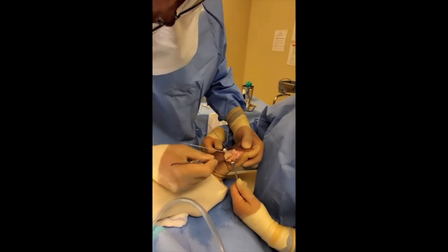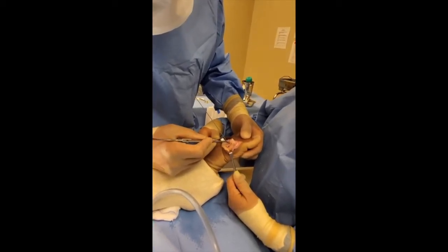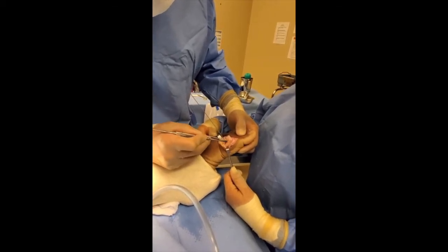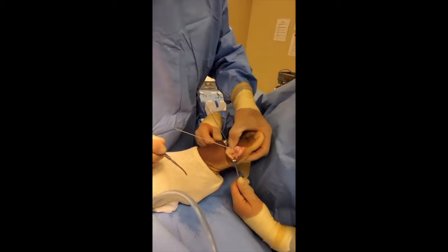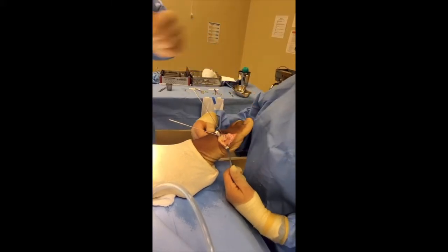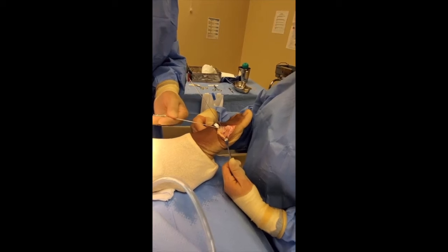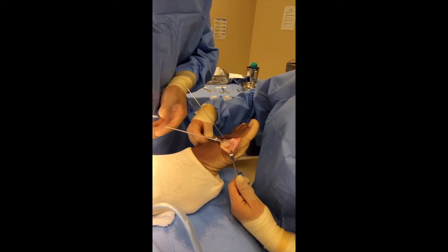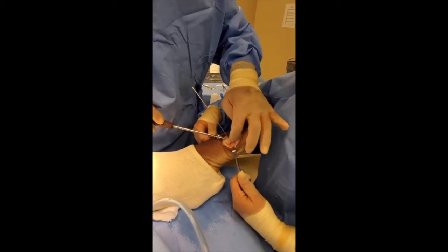The bone was cut from here, stopped there, and went back that way. We took the wedge out to shorten this bone backwards, temporarily put the bone back together to hold it in place, put a guide pin in — that's where the screw is going to go — and countersunk the top of the bone. The screw goes over the cannulated pin right there, down into the hole, and we tighten this bone to that side.